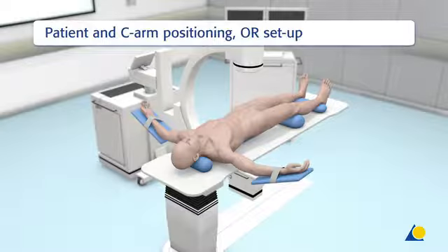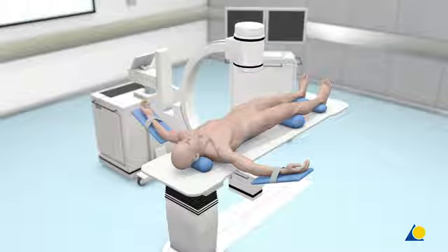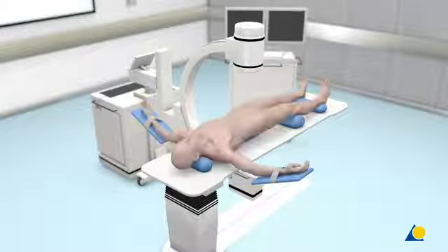Patient and C-arm positioning, OR setup. The patient is placed in the supine position on the operating table. It is mandatory that the table is radiolucent so that intraoperative image intensification control may be used. A small radiolucent bump is placed under the sacrum to raise the pelvis slightly, to allow the soft tissue to fall away from the incision and allow access posteriorly for percutaneous placement of the iliosacral screw.